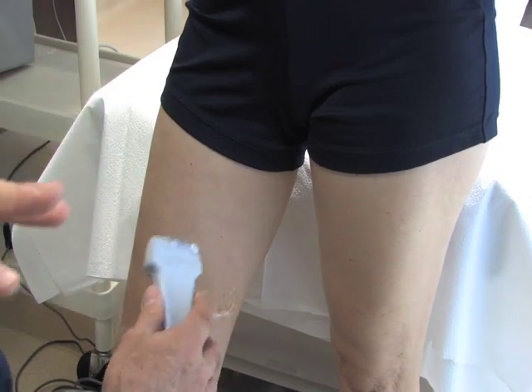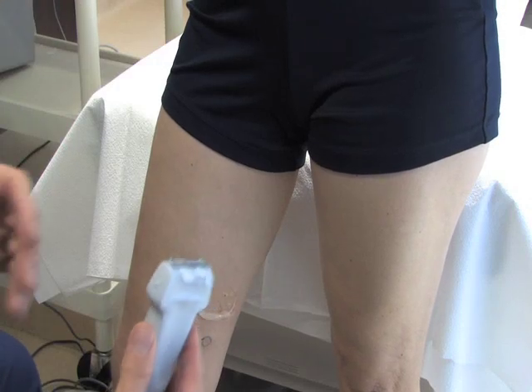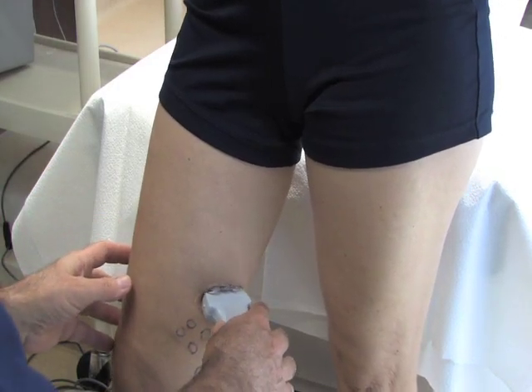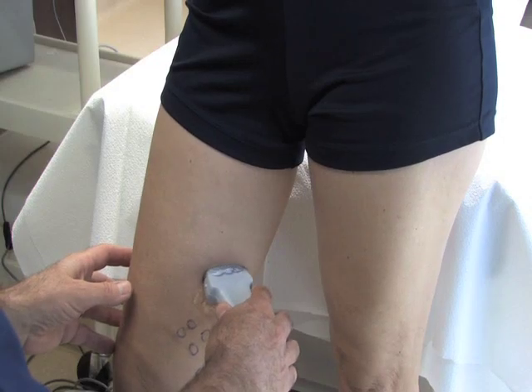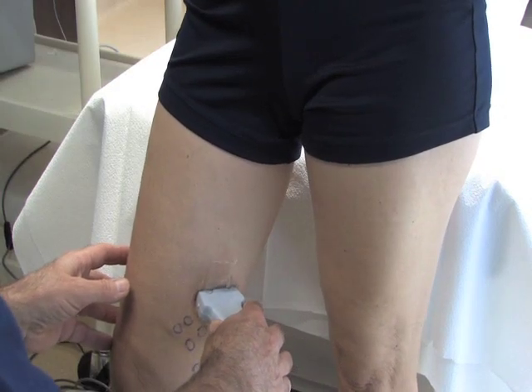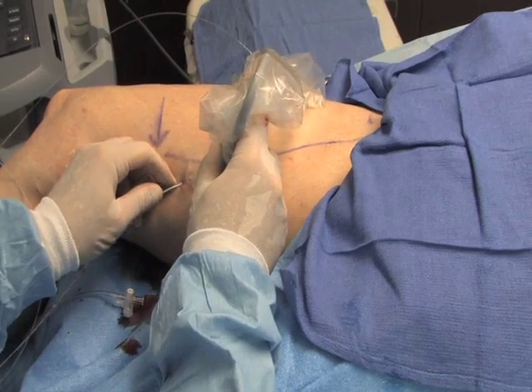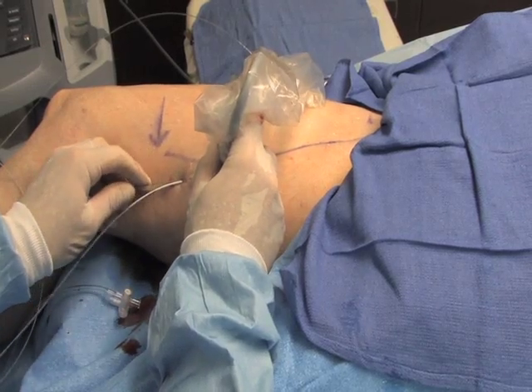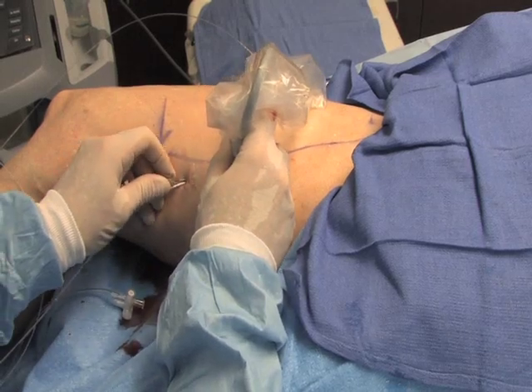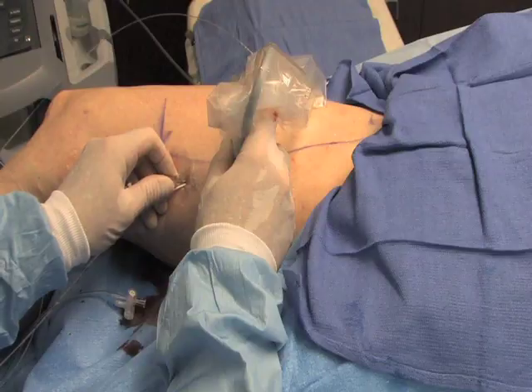After discussion of the various diagnostic and therapeutic options, the decision is made to use ultrasound to assess for valvular incompetence of the superficial venous system of her lower extremity, and if present, to guide endovenous laser therapy, or EVLT, to thermally seal her right greater saphenous vein and resolve her varicosities.